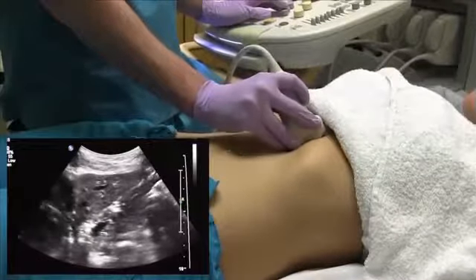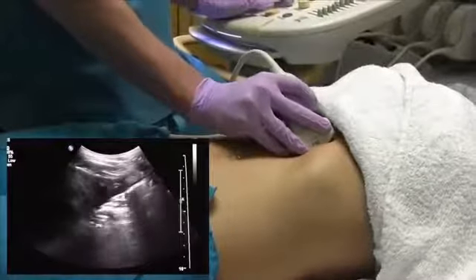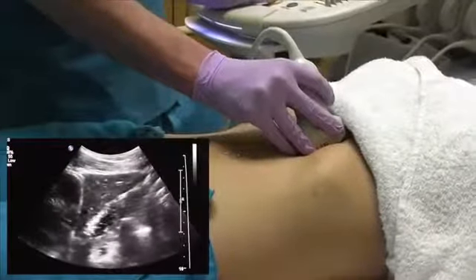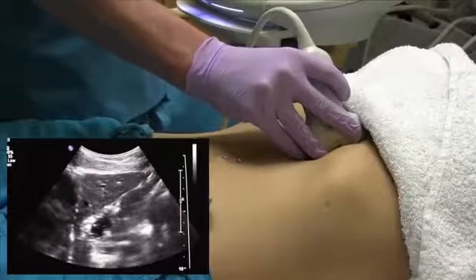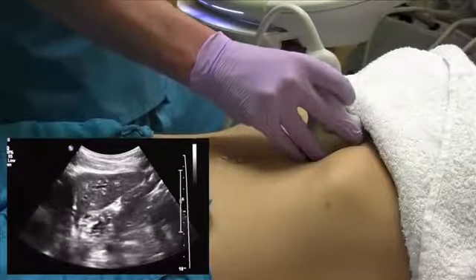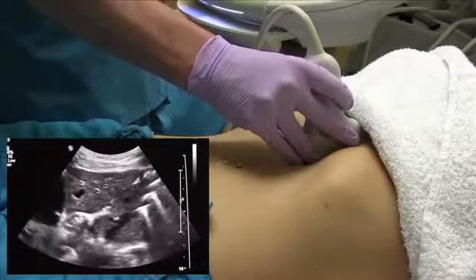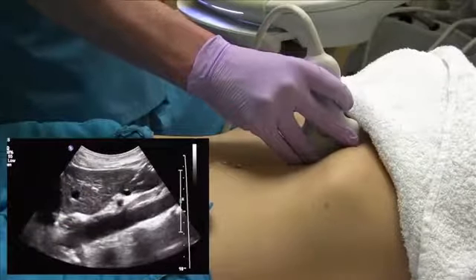and we're going to first sweep all the way out through the left lobe, start to come back. First picture that I usually take is the lateral left lobe. Next picture, we come through more medial, and you're going to start to see the aorta come into the picture here. This is my next picture.